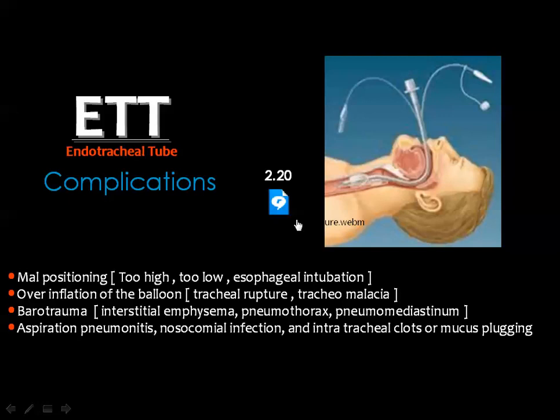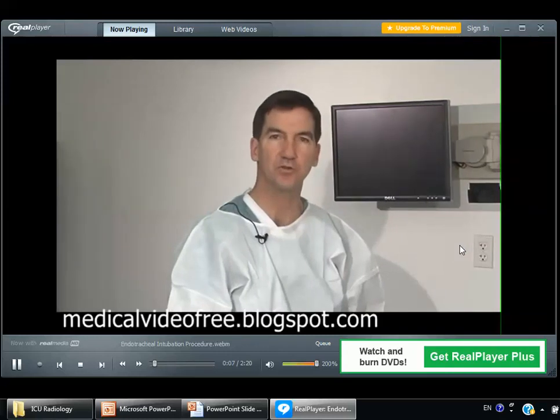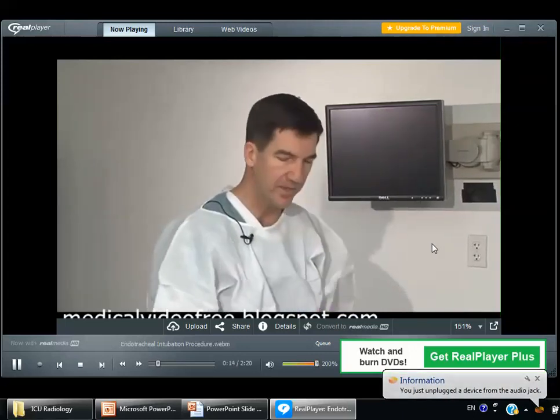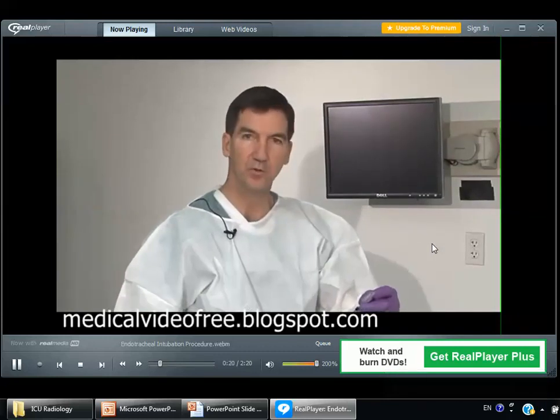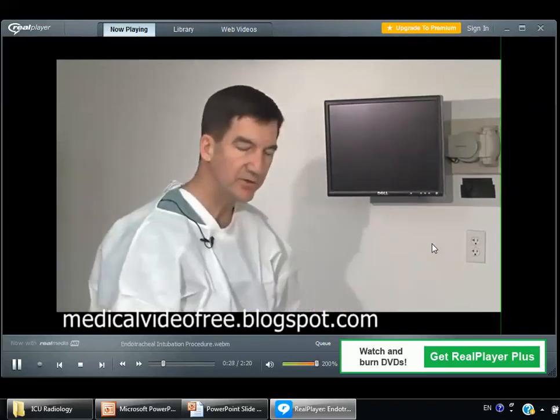Then this is one of the videos that can show you how to insert the endotracheal tube. We want to make sure that we have a tube in the trachea with the cuff inflated. That's the definition of a secure airway. As you prepare, you want to make sure all your equipment is ready to go. The laryngoscope is powered, bulb is working, endotracheal tube with a stylet in place. The tip of the stylet, of course, recessed from the end of the tube. Inflate your cuff to make sure that it's working. Suction is available as well.